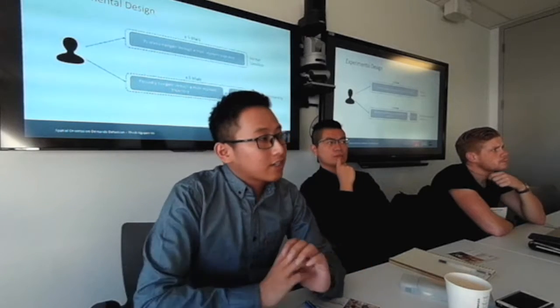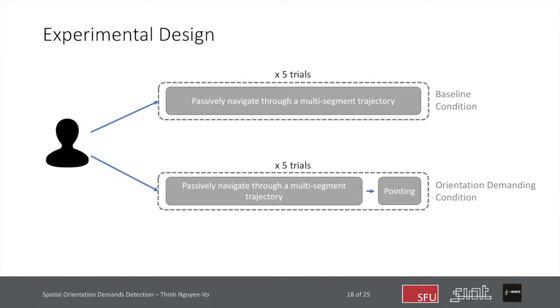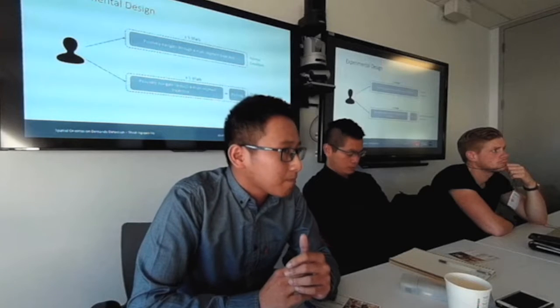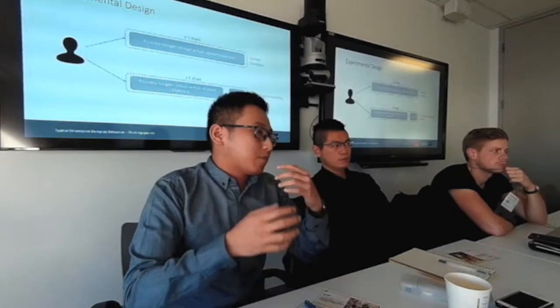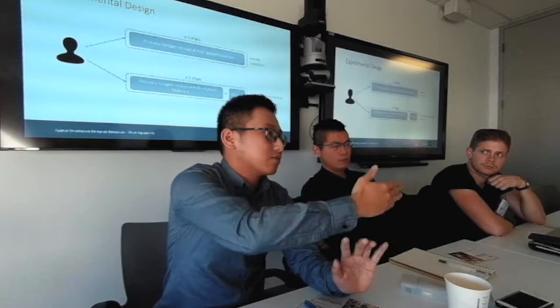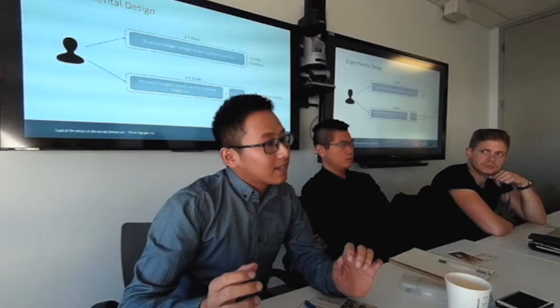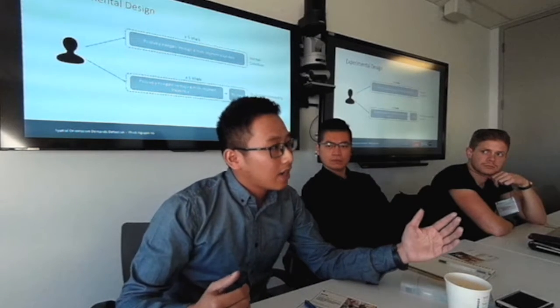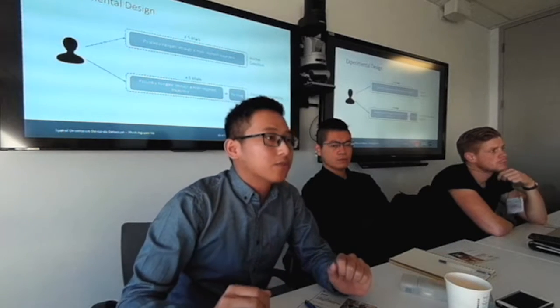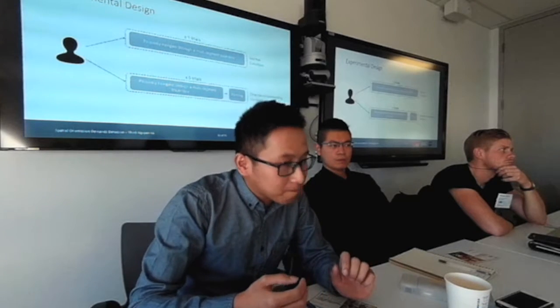In order to collect the data, we designed a within-subject experiment where each participant experiences both conditions, the normal condition and the orientation demanding condition. In the normal condition, they were presented with a virtual environment and passively navigated through a multi-segment trajectory. In the orientation demanding condition, they have an additional task: at the end of every trajectory, they have to point back to the origin. In other words, they have to pay more attention to their movement, position, and orientation.